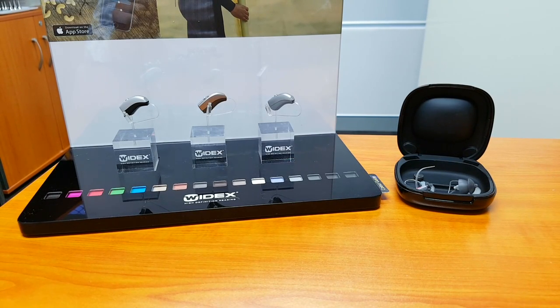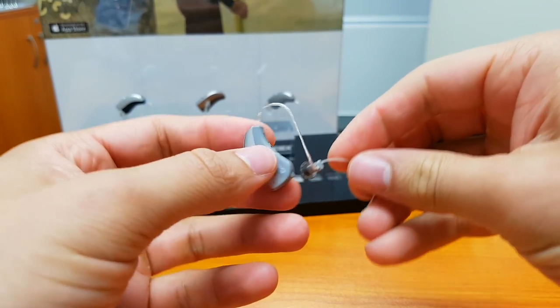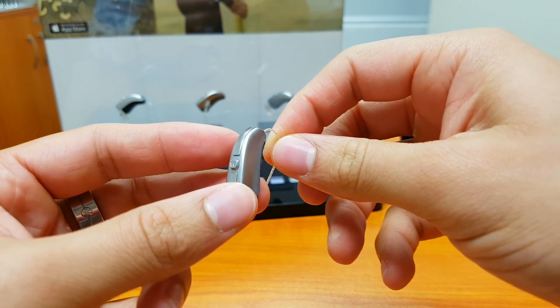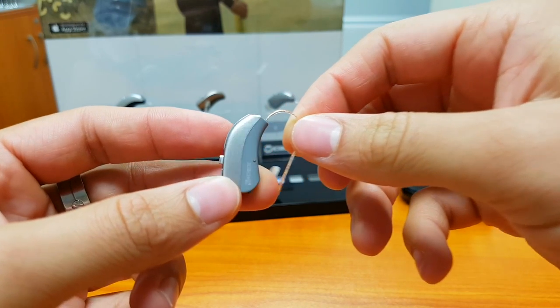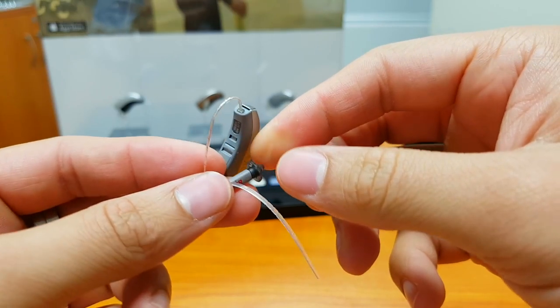What we have today is the latest release from Widex — the Widex Beyond. This is Widex's first made for iPhone hearing aid, and it is only available at this stage in the Fusion or receiver-in-the-ear model.